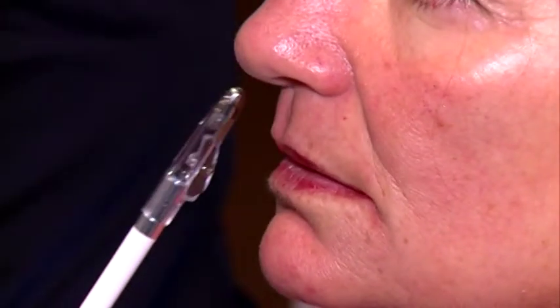So it has two effects. This creates volume here a little bit, and this is like a hypomochlion. So if these are my teeth, and this is my lip, this is my HA, the HA presses the lip outwards, and it everts the lip. If you like to have volume, this might not be sufficient.